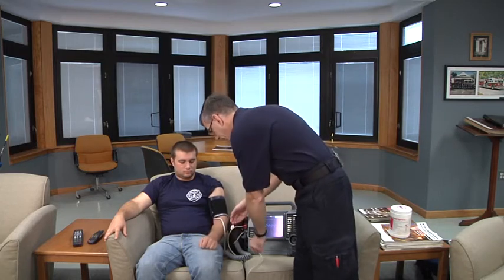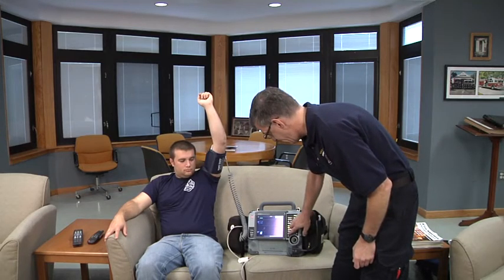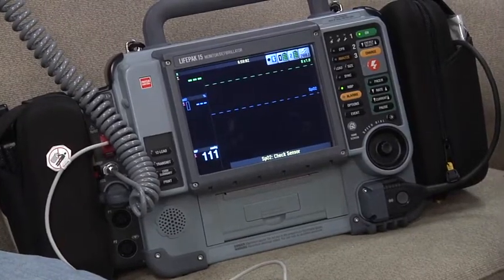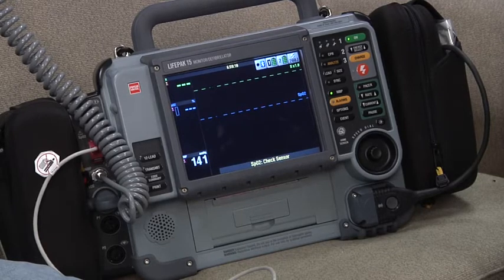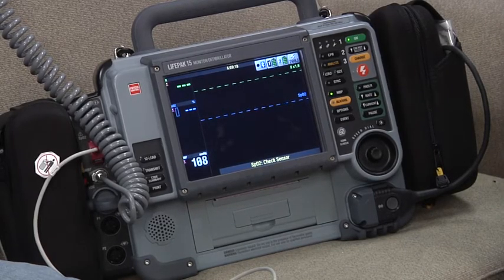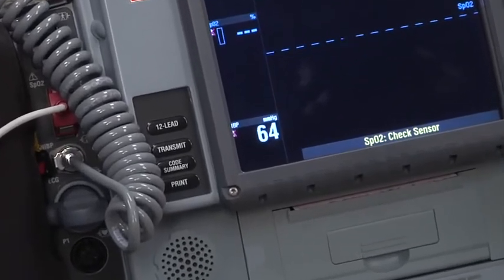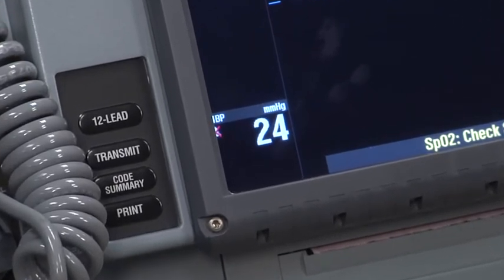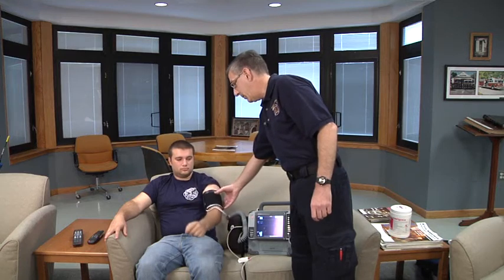Now let me show you what would happen if we were to elevate the arm above the level of the heart. We'll take the oximeter off and ask the patient to raise his arm up in the air. We'll cycle the blood pressure cuff again. The cuff is pumping up, putting air in and measuring the mean pressure and heart rate as it deflates. With his arm above the level of the heart, we're going to obtain a pressure that's considerably lower than the 126 systolic we had with his arm at mid-heart level. So it's important to keep those considerations in mind when measuring pressure with an electronic device.